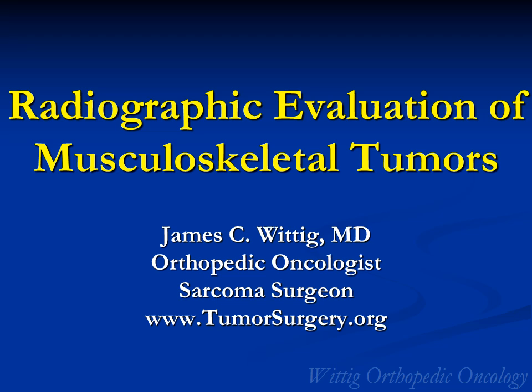Today we're going to talk about the radiographic evaluation of musculoskeletal tumors.